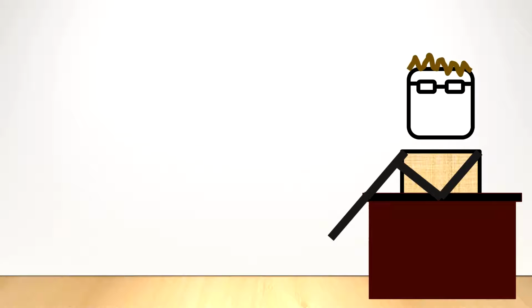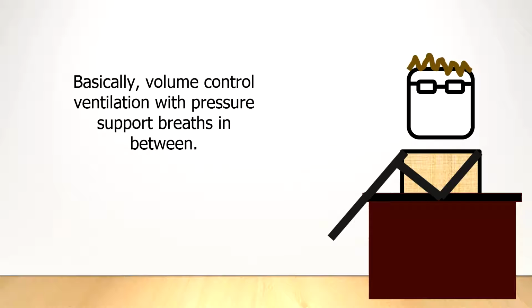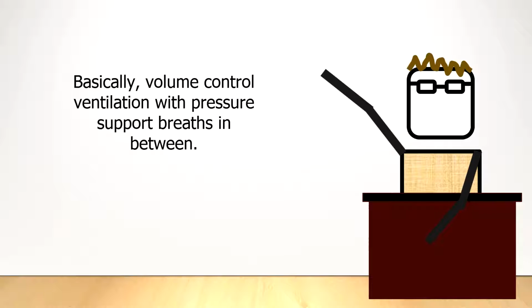Recall from a previous talk that the breath sequence can either be continuous mandatory ventilation, which is what we usually do, or continuous spontaneous ventilation, which is commonly used in pressure support ventilation. The in-between is called intermittent mandatory ventilation.